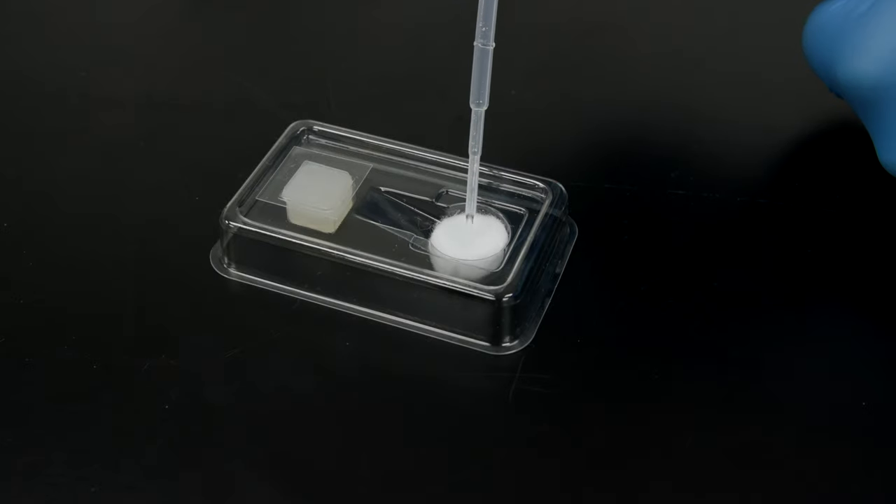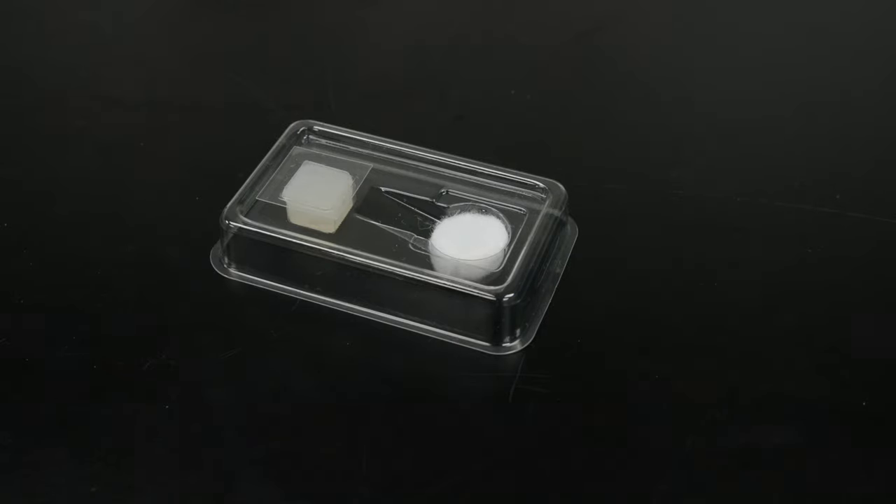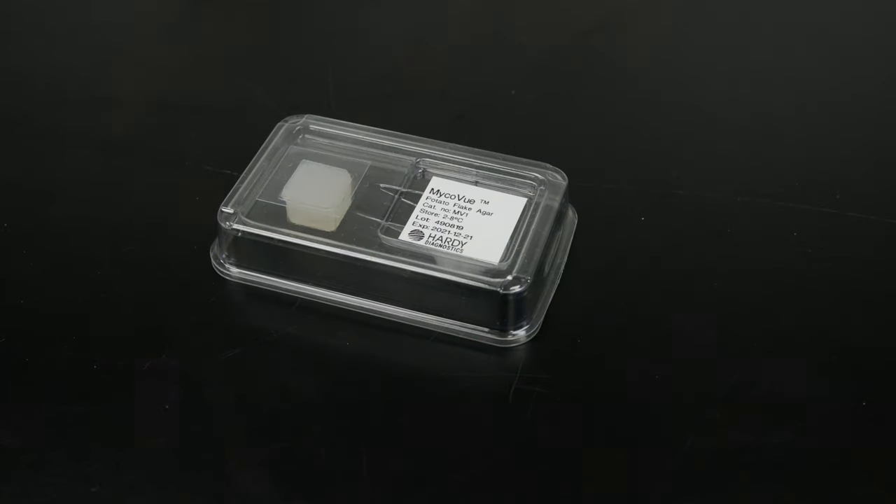Add approximately 1 ml of sterile water to the white sponge. This will keep the media hydrated and prevent shrinkage during incubation. Replace the lid of the device and incubate at 25 degrees Celsius.